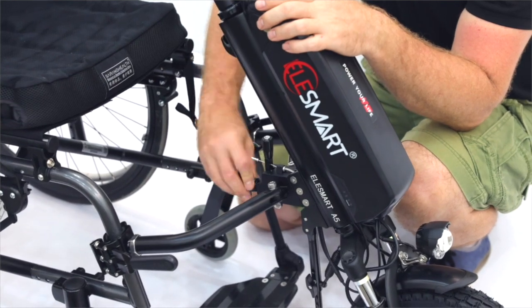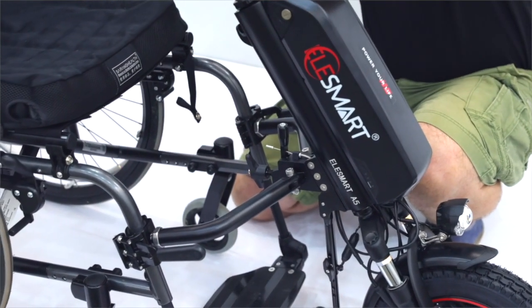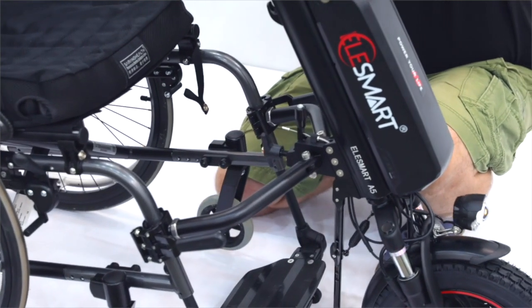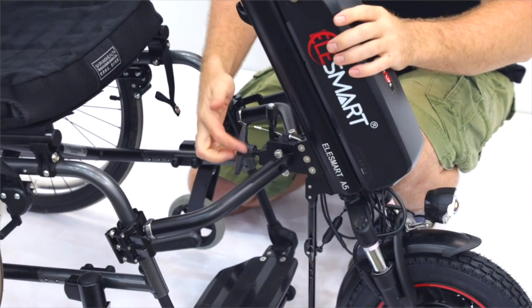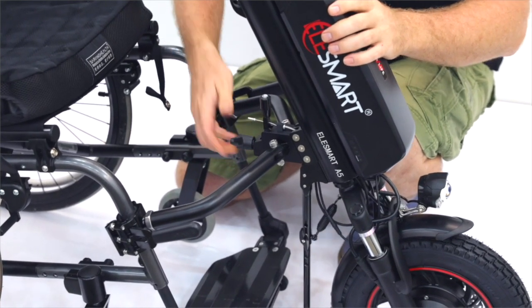Adjustments to our electric hand cycle, we can raise it into position. To do that, we loosen this screw and simply take the handlebars and bring them up one notch. And we're there. Then tighten the screw down again. And we're good to go.